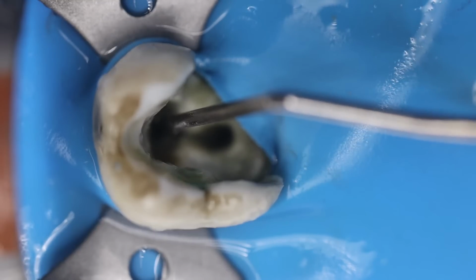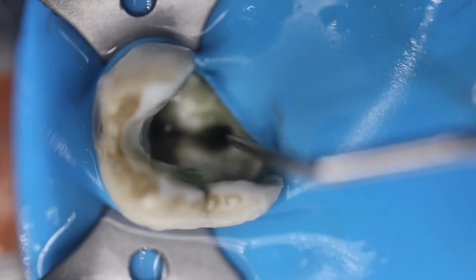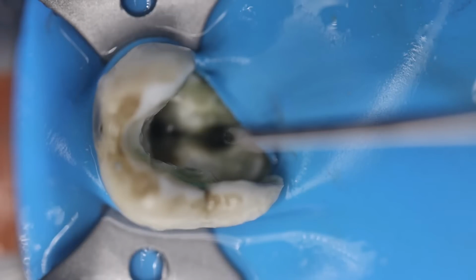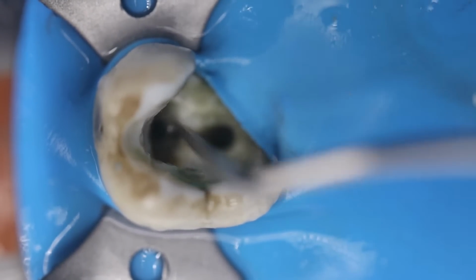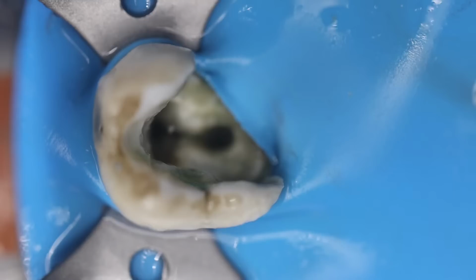If you leave it, it will hang because of its fine tip. Again, go for the distal aspect and you will see that there is again a catch that this probe holds on to. I have left it without any support and it is hanging. So this is basically the catch that happens when the probe gets engaged into the orifices. This is one of the methods to confirm that this is an orifice where there is engagement.